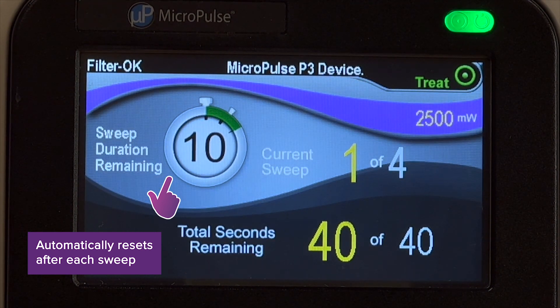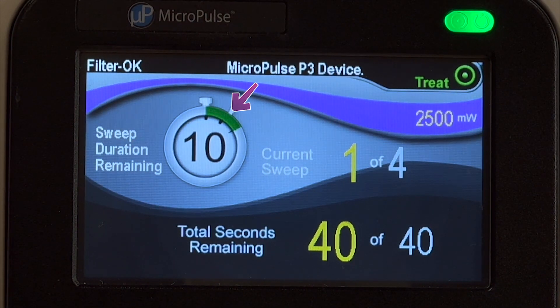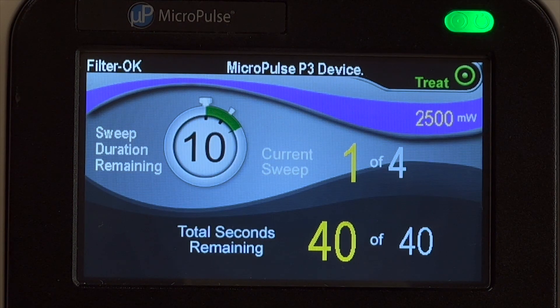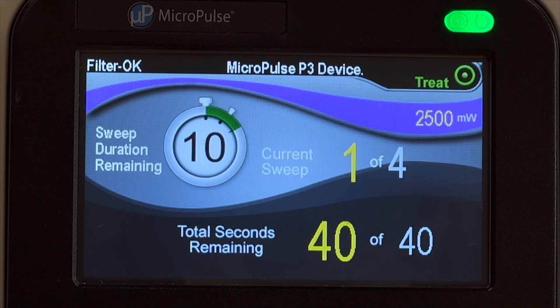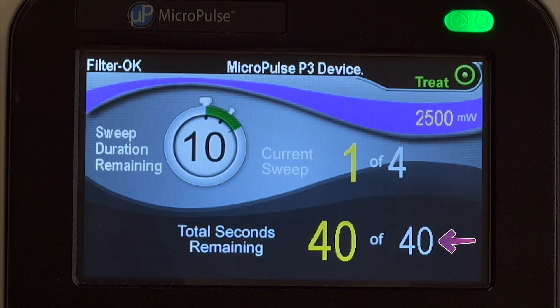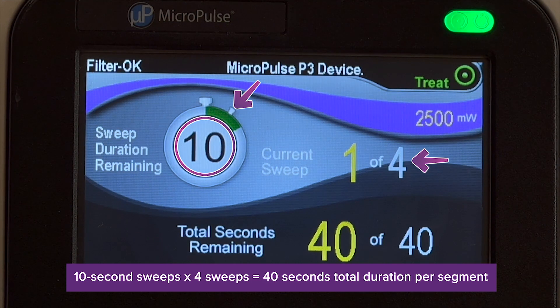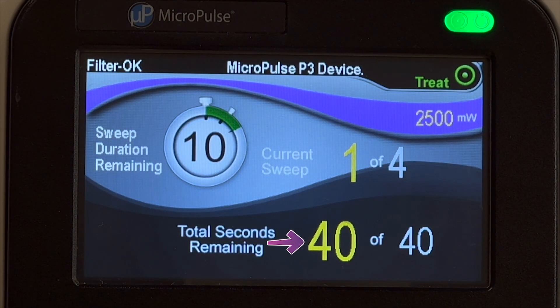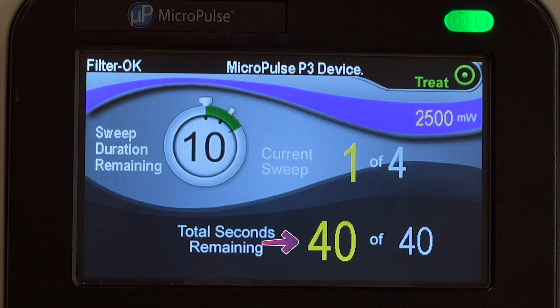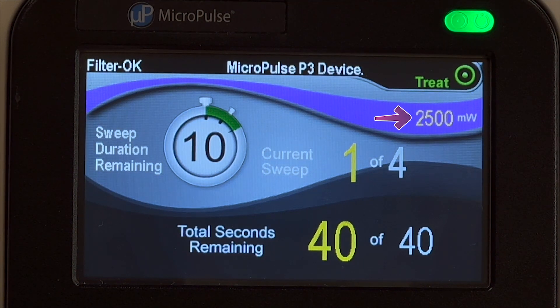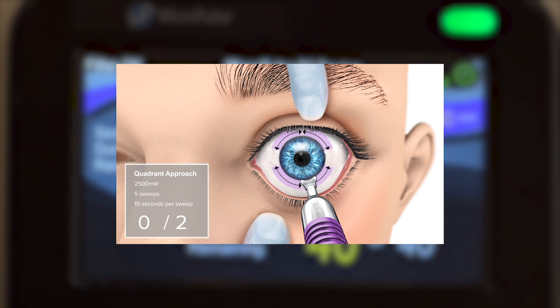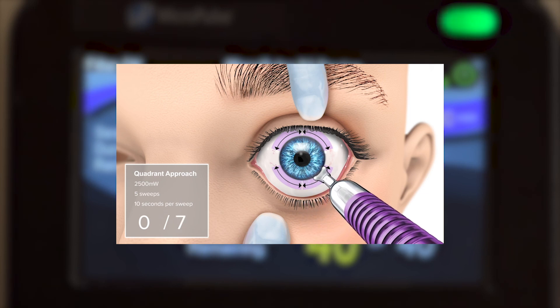This field automatically resets after each sweep. The green bar tracks the remaining time. A single audible tone is played at the halfway point of a sweep, and a double tone at the beginning of the next sweep. The current sweep field displays the total sweeps programmed for a segment and the current sweep being performed. The total seconds remaining field displays the calculated total segment duration based on the programmed duration per sweep and sweeps per segment, with an automatic countdown showing total seconds remaining. The laser will stop firing when this value reaches zero. The selected power is also displayed here. These features help physicians match their desired sweep velocity while sweeping the Micropulse P3 probe back and forth over a given segment.